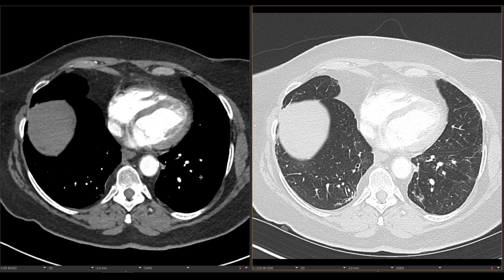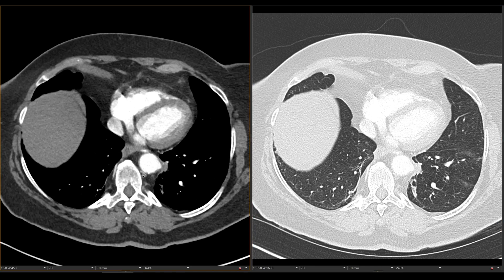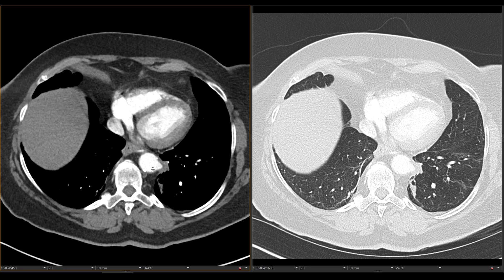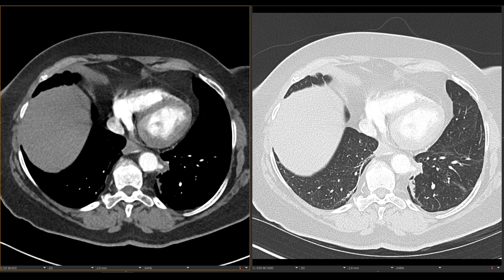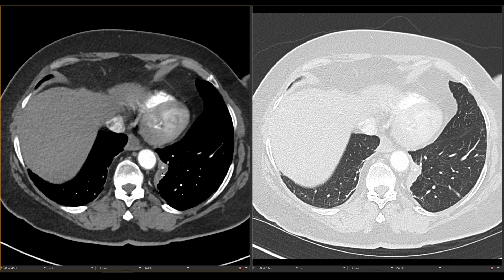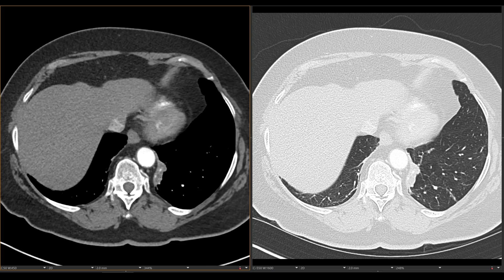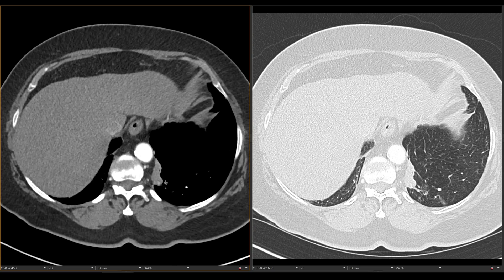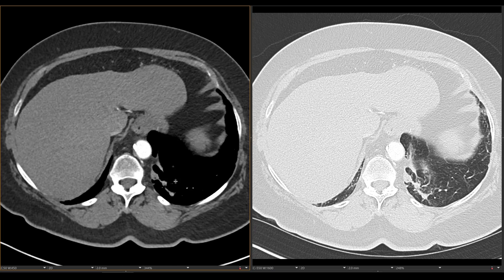When we look at the soft tissue windows, you can see that there is a vessel that arises from the left lateral aspect of the aorta and goes directly into this lesion. So this is something called a bronchopulmonary sequestration.